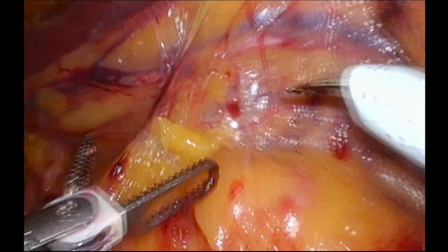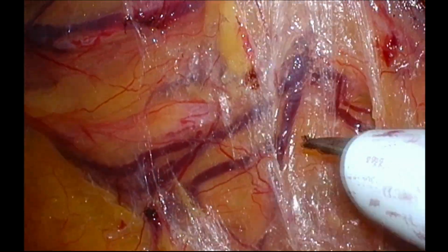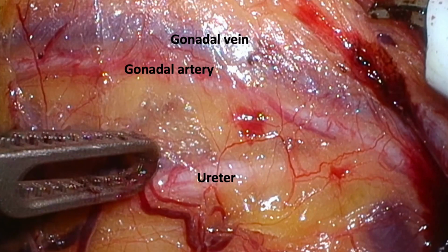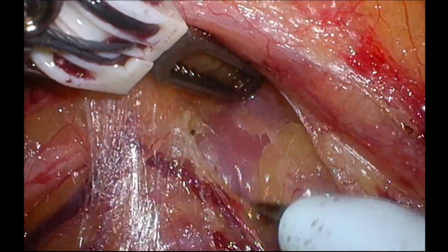Ureterogonadal packet is retracted with prograsp. Further dissection reveals gonadal vein, gonadal artery, and ureter. Ureterogonadal packet is lifted from the psoas muscle.